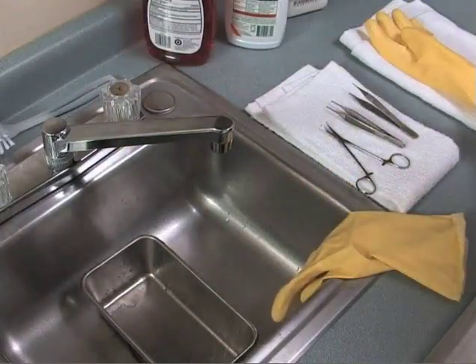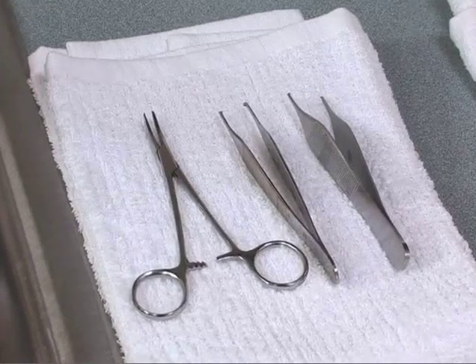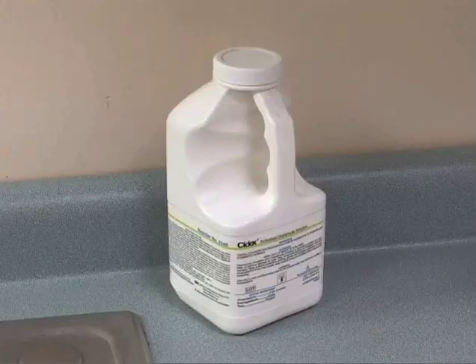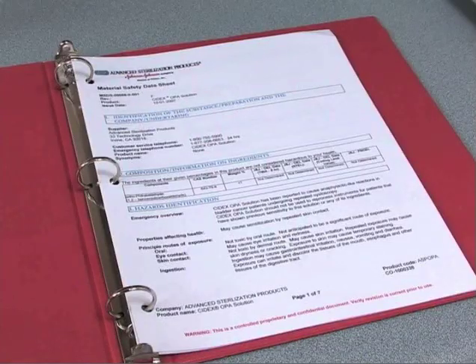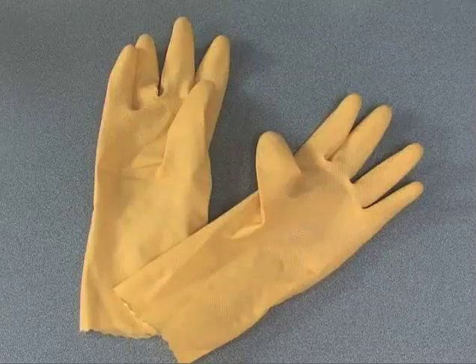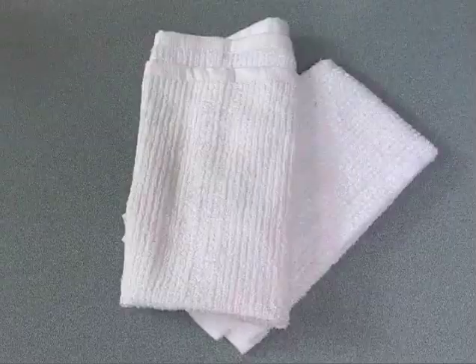With the instrument sanitized, you may move on to disinfection. The materials needed for disinfection are the contaminated articles, the chemical disinfectant itself, the disinfectant's MSDS, disposable exam gloves, utility gloves, a soaking container or basin, paper towels, and cotton towels.